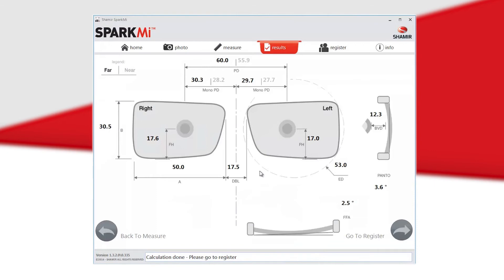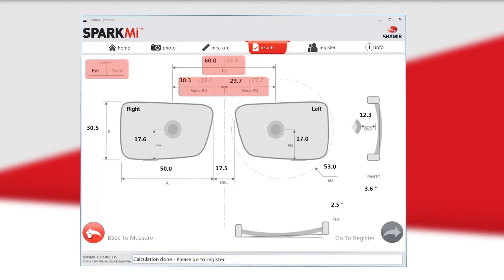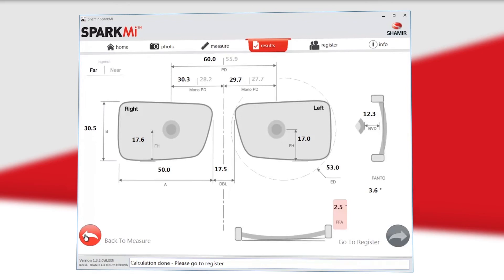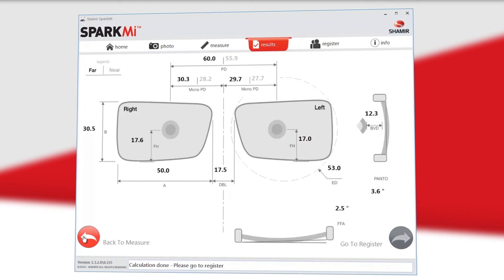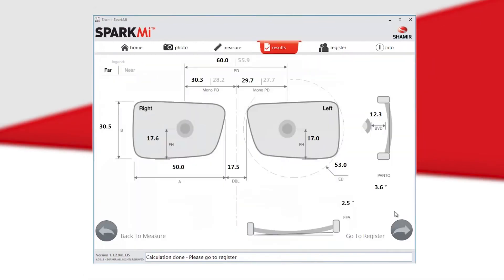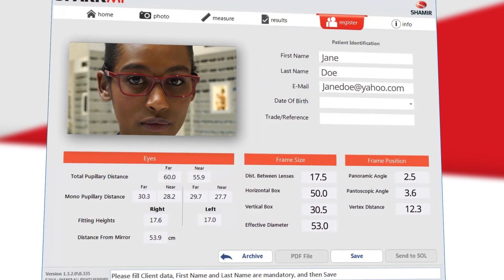The final results will include the patient's far and near PD and mono PD, A, B, and ED measurements, fitting height, DBL, pantoscopic tilt, panoramic angle or face form angle, and back vertex distance. If you notice any measurement that may be extremely off, this may be a result of not marking a point on either the upper or lower image. You can go back to the measurement screen and adjust the points. Once you have marked all points and viewed the results, you may save the results by selecting Register, typing the patient's info, and pressing Save.